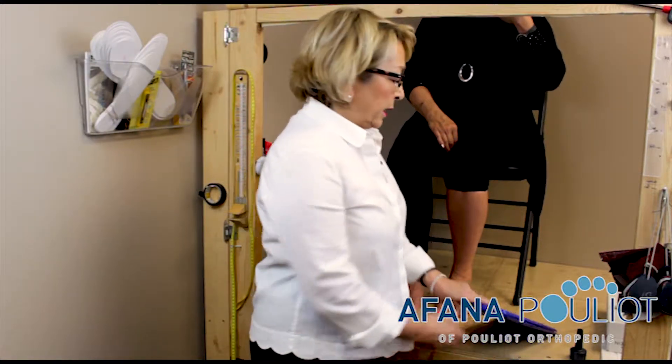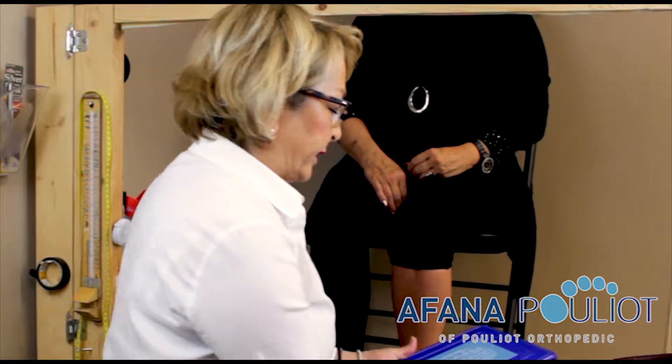All right, so now we're going to talk about how to use the photoprint. This is an ancient tool, but it gives you great details.